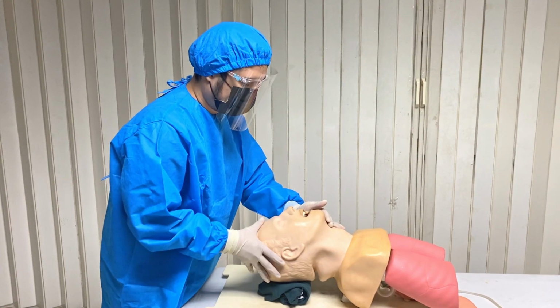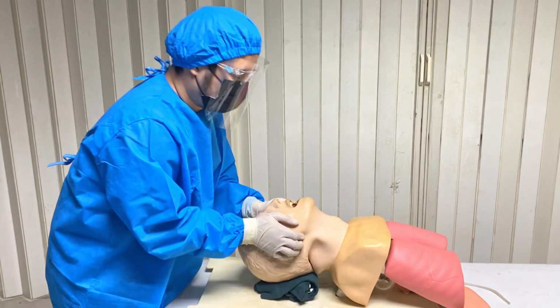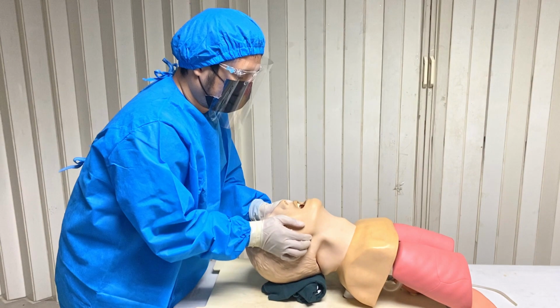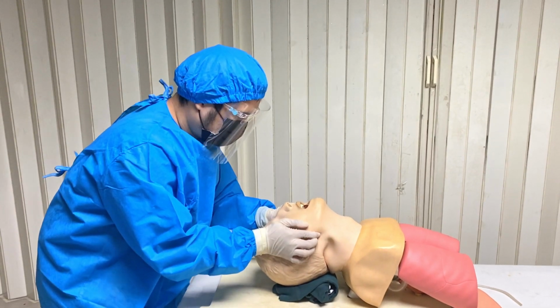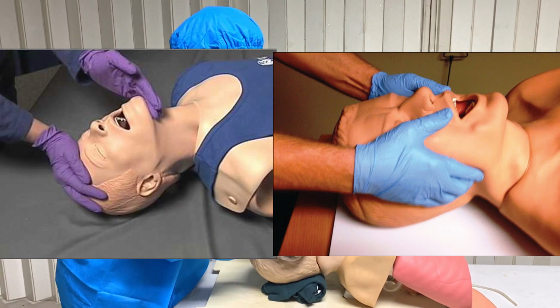Next, do a chin lift or jaw thrust maneuver in order to displace the tongue anteriorly. To do the jaw thrust maneuver, place your palm on the patient's temples and your fingers under the mandibular rami. Lift the mandible upward with your finger until the lower incisors are higher than the upper incisors.